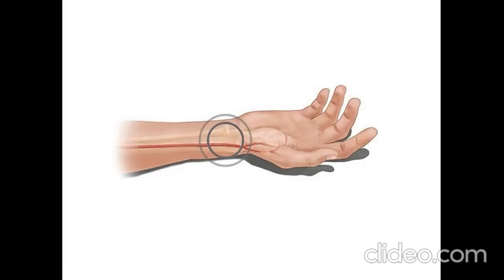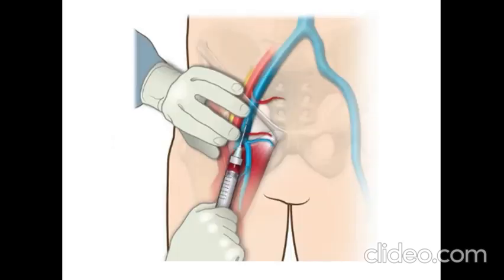A right radial artery access was obtained for arterial angiography. Similarly, a right femoral venous access was obtained.